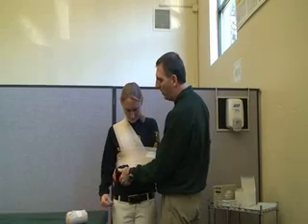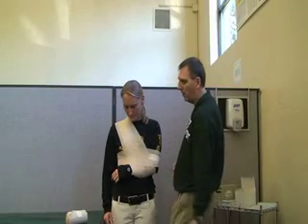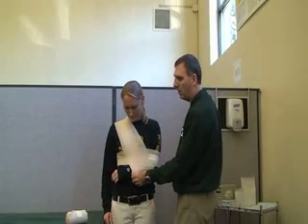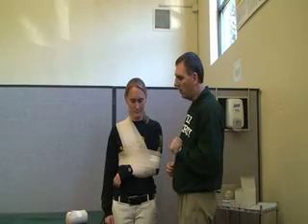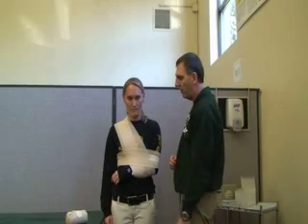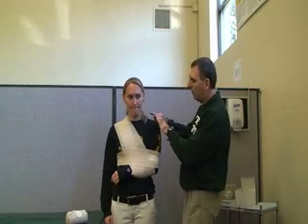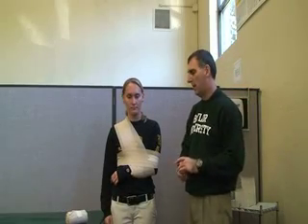The last thing we want to make sure is to check circulation — the pulse at the wrist or the fingers. We also want to make sure she has the full weight of the arm supported, so the arm doesn't go down or out, which would be painful in both directions. Check the injury and make sure it's secure, and have the patient follow up to see a doctor.